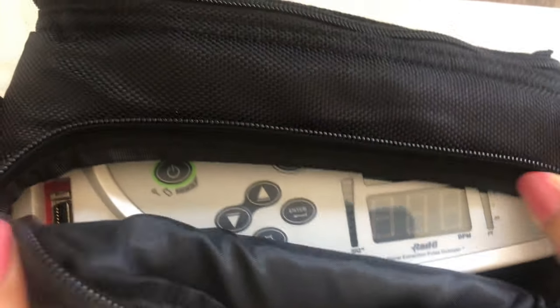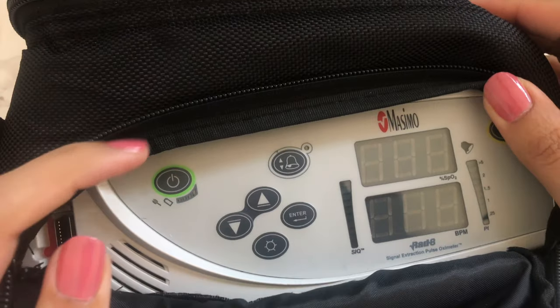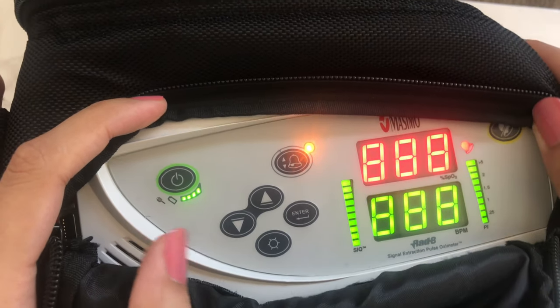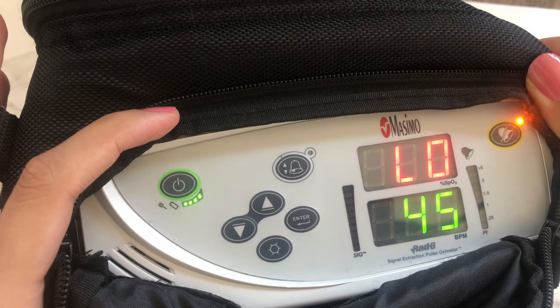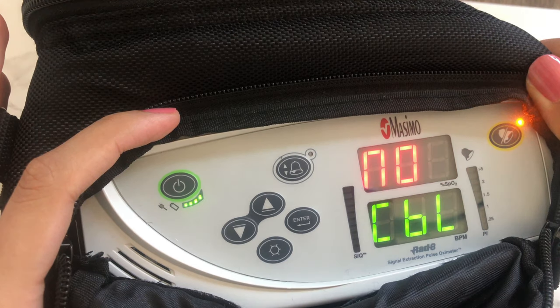Let's take a look at the interface. The power button is outlined in green. Hold the power button pressed for a couple of seconds and wait for the beep to signal it's been turned on. The display will flash and run through the settings: standard setting, low oxygen limit, high oxygen limit, low pulse limit, high pulse limit, and 8-second average.